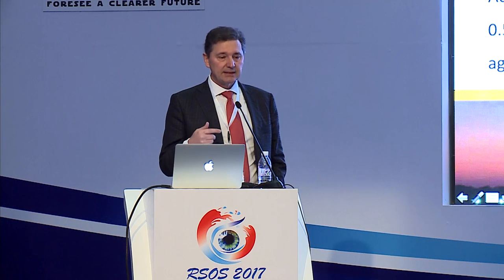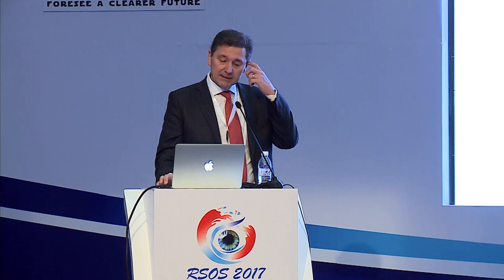Karina Rocha, looking at adaptive optics, has seen how much spherical aberration you can tolerate. And again, the amount you can tolerate is around about 0.6, and that allows you to do a plus 7 correction for hyperopia. The Visx device, it's approved up to plus 6, although most users would limit it to plus 5 at most, and in fact, most users don't go more than plus 3.5.